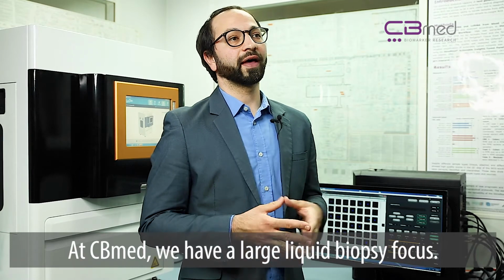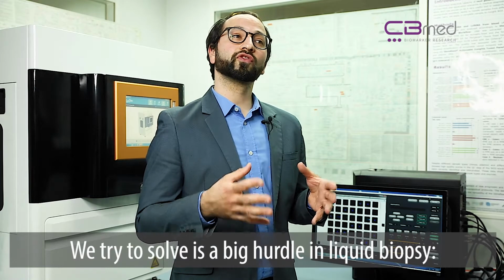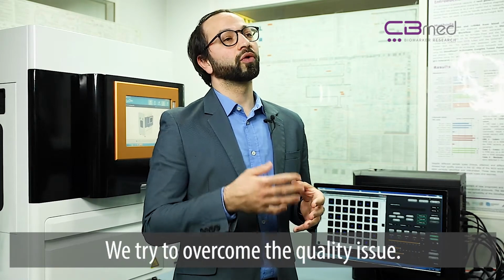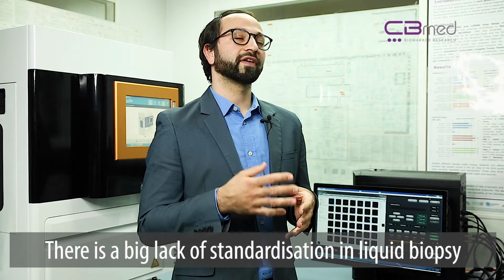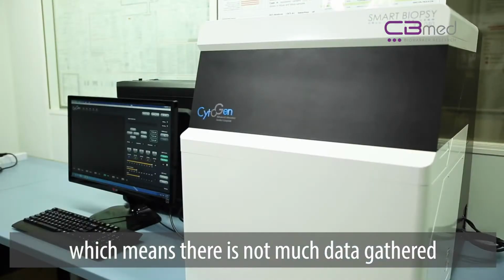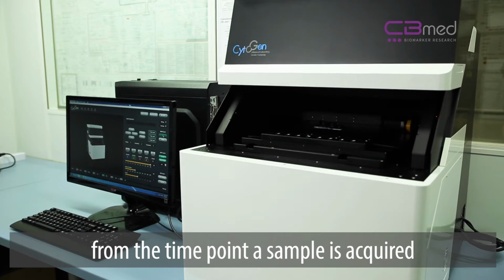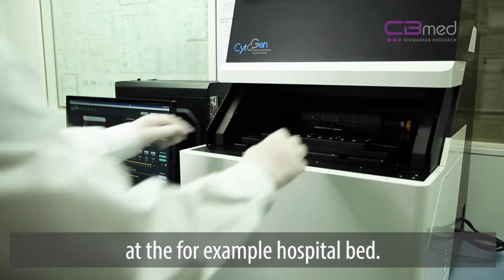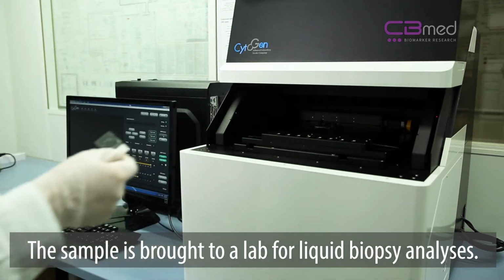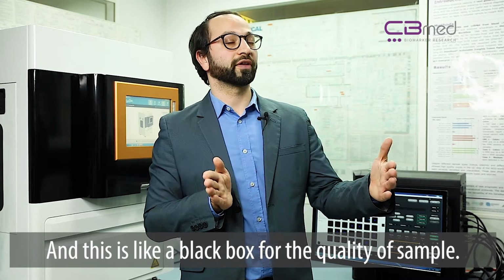So at CBmed, we have a very large liquid biopsy focus. And what we try to solve is a big hurdle in liquid biopsy. We try to overcome the quality issue. So there's a big lack of standardization in the liquid biopsy field, which means there's not much data gathered from the time point a sample is acquired at, for example, the hospital bed. The sample is brought to a lab for liquid biopsy analysis. And this is like a black box for the quality of the sample.